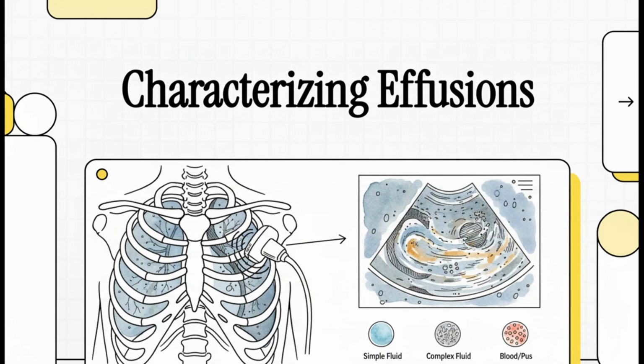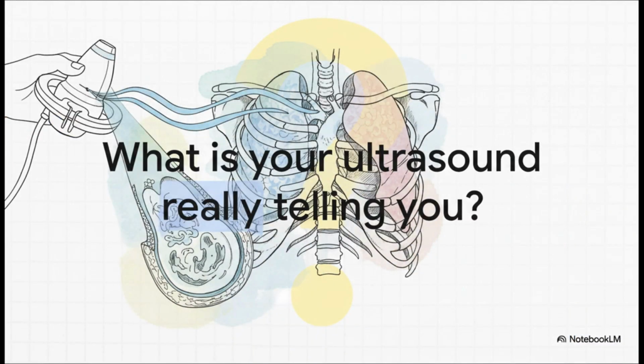Okay, let's get right into it. When we're scanning the chest and we find a pleural effusion, our job is far from over. In fact, that's really just the starting line. The true power of bedside ultrasound is in characterizing that fluid, giving us major clues about what's going on and, more importantly, how we should manage it.